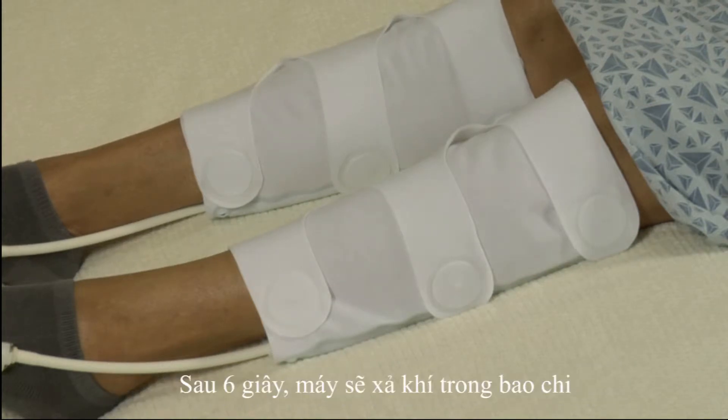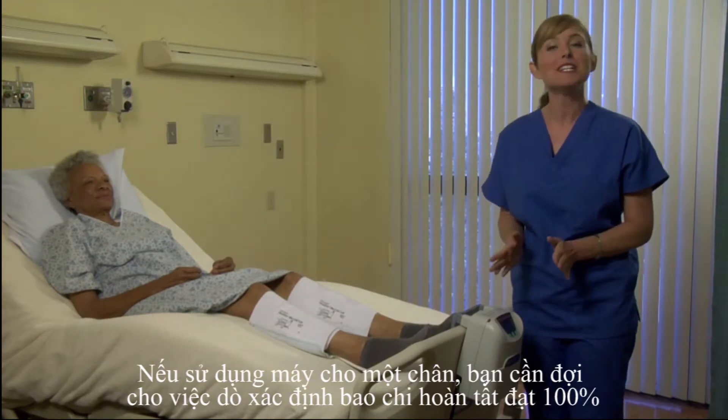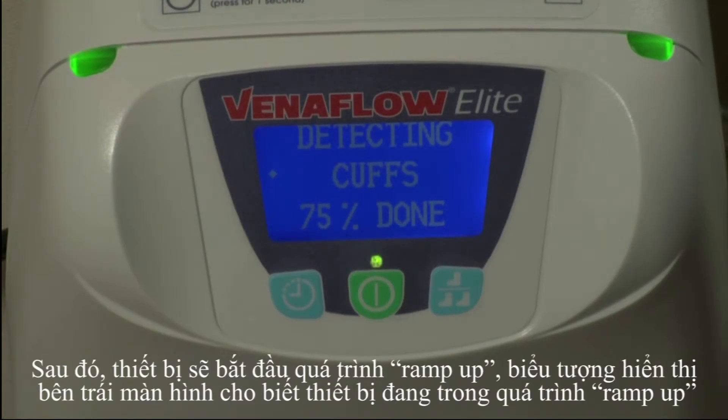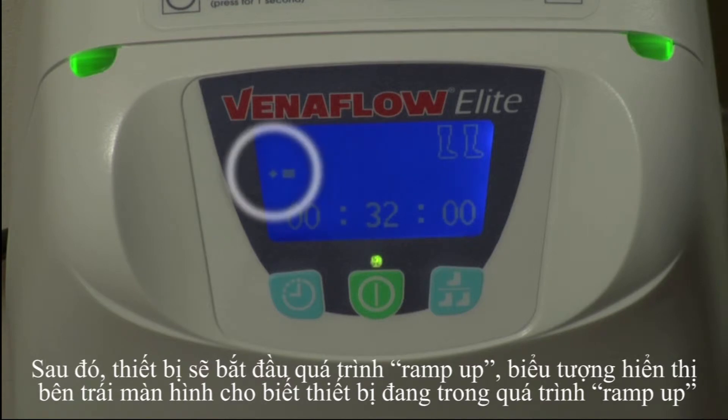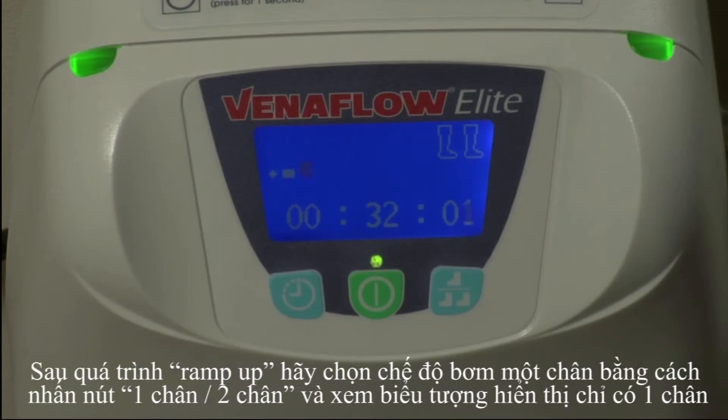After six seconds, the cuffs deflate. If you'd like a single leg application only, you must wait for cuff detection to complete at 100%, and then the screen will switch to ramp up. The screen will show a diamond icon on the left side indicating ramp up. When that diamond is gone, ramp up is complete. During the three minute ramp up period, you must select single leg application if desired. Simply press the single/dual leg button and check that there's only one leg icon featured on the screen.